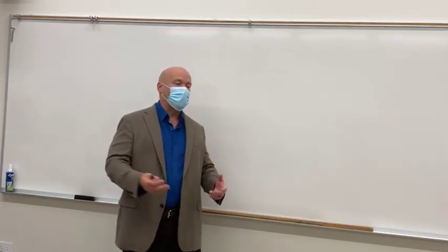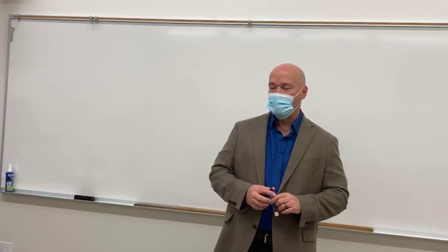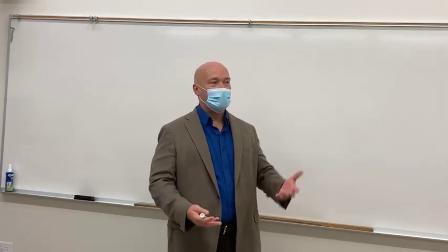If we're talking about quality of the x-ray beam, what are we trying to accomplish in making an x-ray? What do we have to have in order to see the x-rays, like what you can barely see over there because the lights are off? What does the x-ray beam have to do in order to give us that? That's penetrate, right? So KVP controls penetration. Penetration is the quality of the x-ray beam.